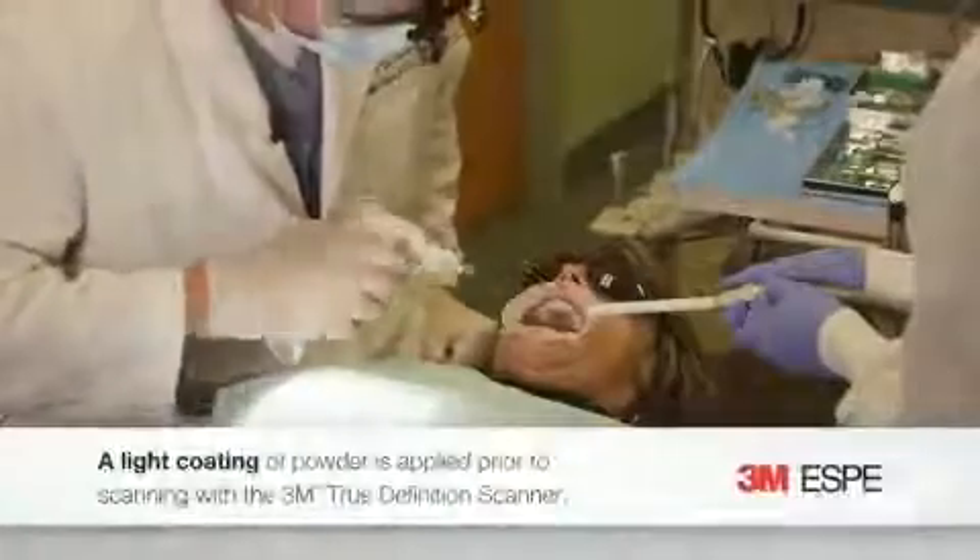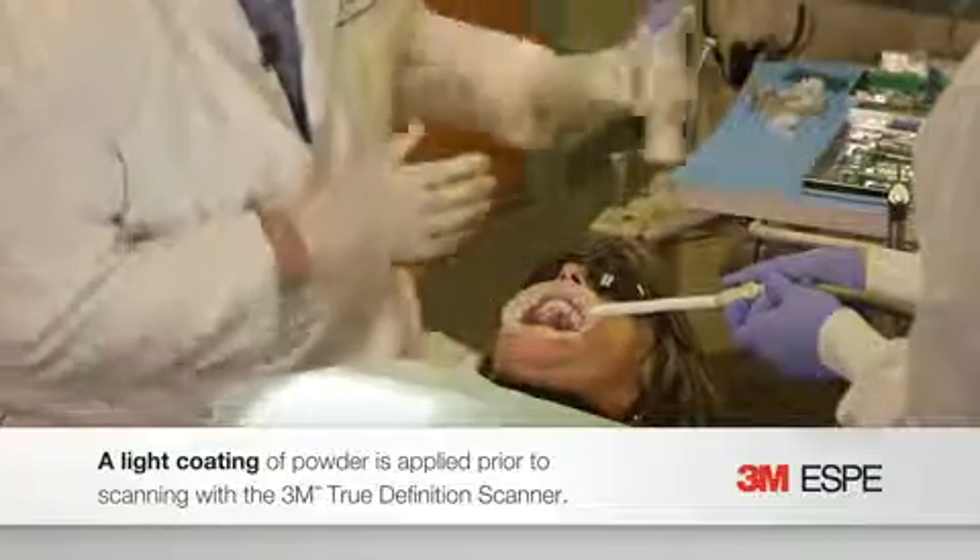You can see how easy it is to powder. It's really fast — it only takes 30 seconds or so to powder, even an entire arch.